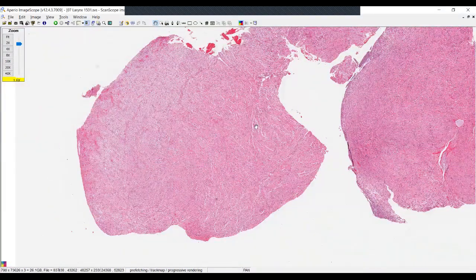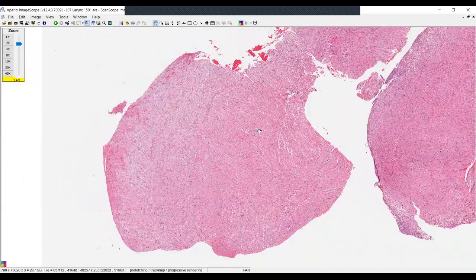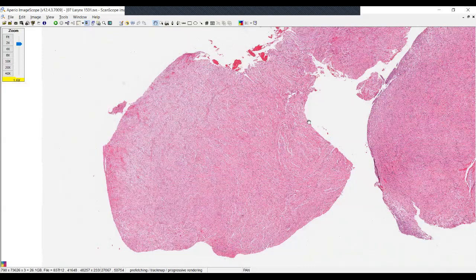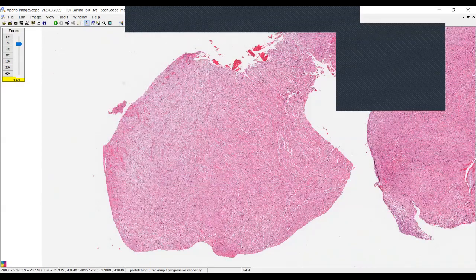Remember that doing epithelial markers, generally a P40, P63, or CK5/6, are going to be more meaningful, along with things like a pan-cytokeratin or OSCAR, in order to be able to confirm the diagnosis. Still, 30% of cases will be non-reactive with epithelial markers, and therefore you must remember that you can still call it a spindle squamous cell carcinoma, even though you may not have an epithelial marker present.